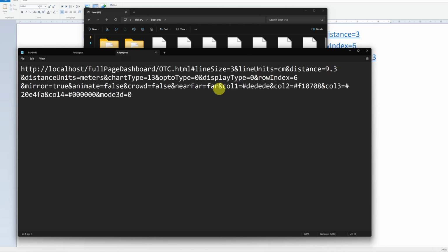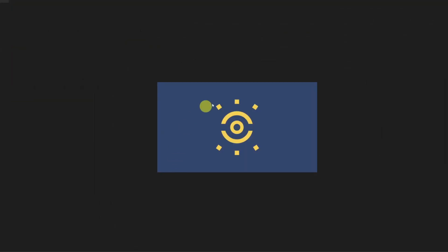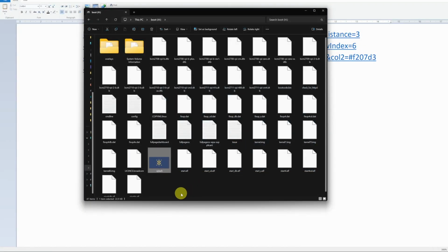Obviously this will depend upon your room, but I just wanted to show you that you would just go in here, select that, edit it, and then save that file on your SD card here, and then when it boots up it'll have the right settings. Another small thing, obviously there's lots you can go into with this, but one of the things is you could change the splash page to a PNG file. This is our logo, but if you changed it, when it booted up it would show your logo, but that's neither here nor there.